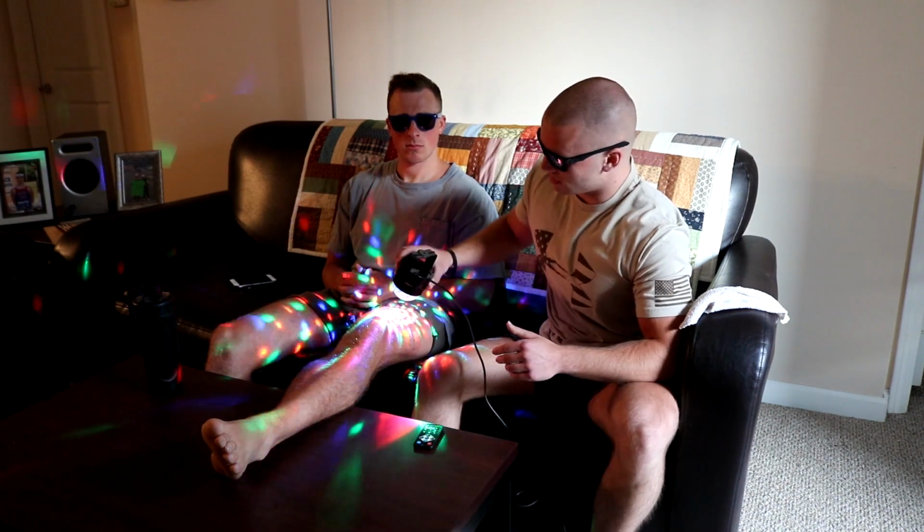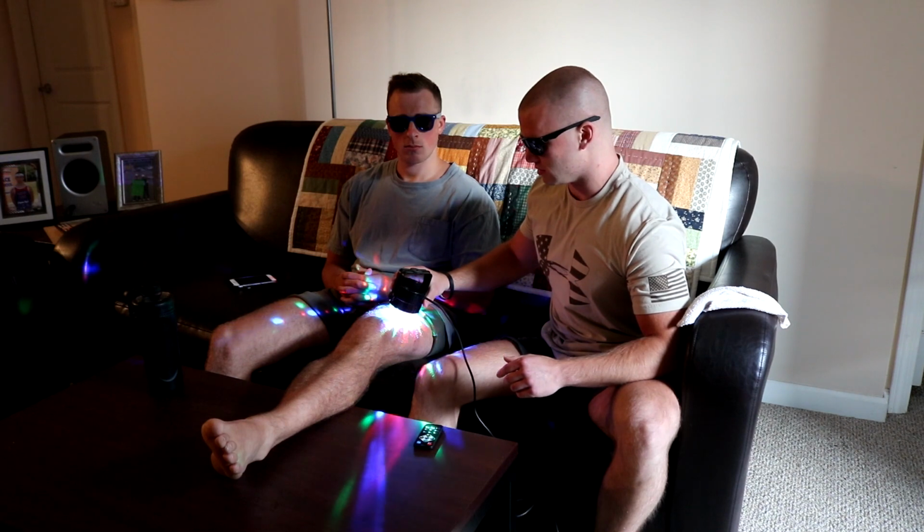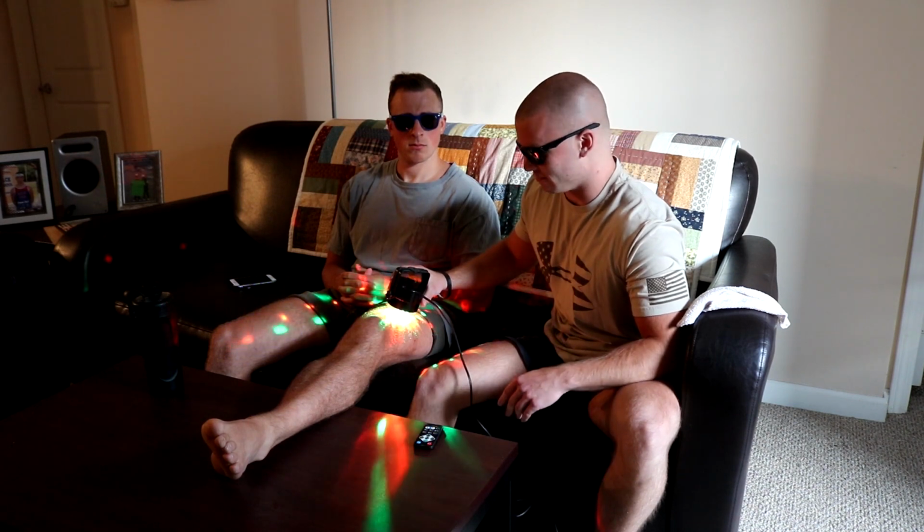And then you'll apply it to the area, and you're going to hold this here. Check in with the patient as needed. Since you'll be here, you probably just have a casual conversation with them. Check the area, make sure they're not having any adverse reactions.